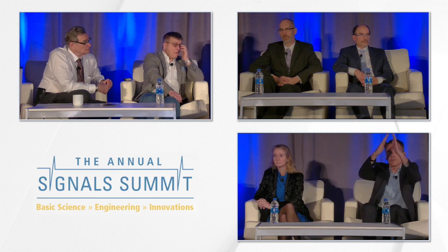Yes, what I meant was you bring the patient into a sinus rhythm. We started a couple of years ago already with the coronary sinus, where you can stimulate in 1-2 and in 9-10. And then you already get 2 directions, which helps a lot. Yeah. But the best way is this new technique that I proposed. Thank you all. Thank you.